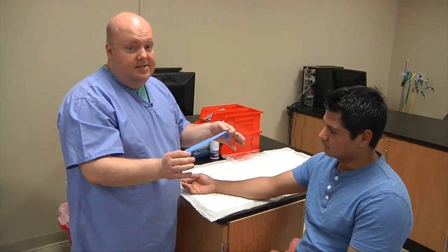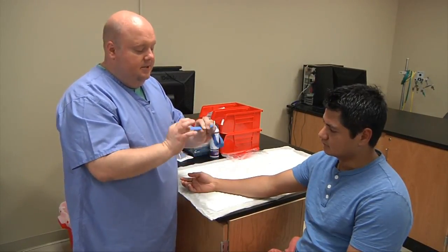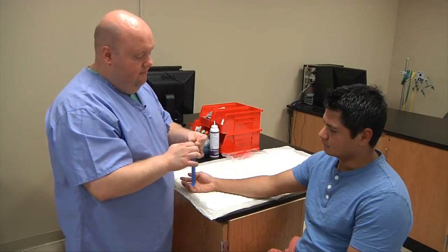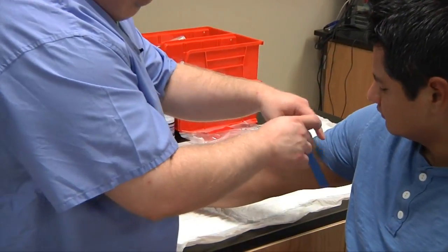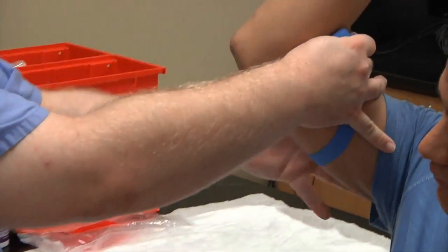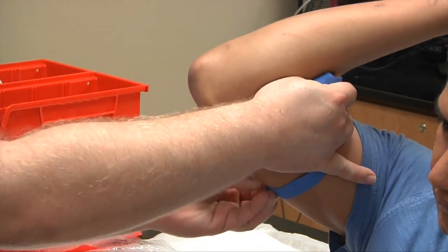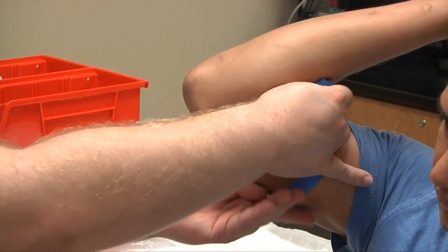We have our non-latex tourniquet — make sure it's good and intact, with no rips or tears and no signs of soil on it. Going to place it around the patient's arm. You want to keep it flat in the back; notice it's still smooth and flush. We try not to let the tourniquet roll, as that will cause the patient extra pain.